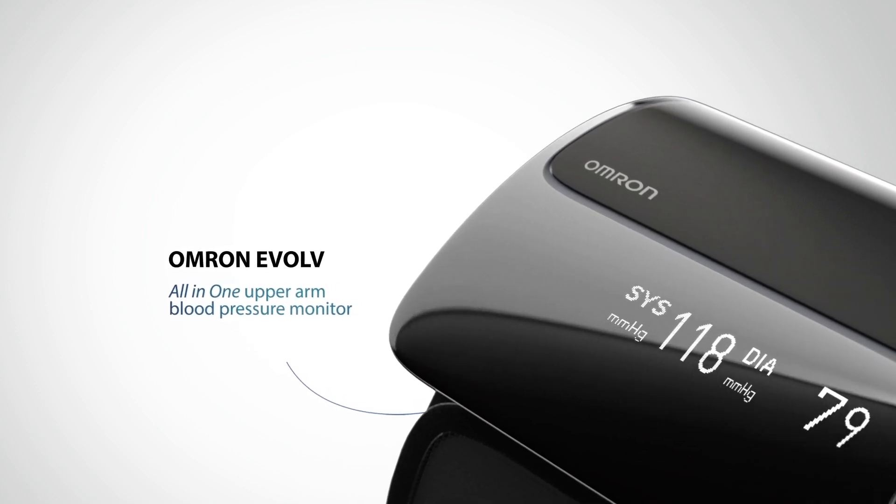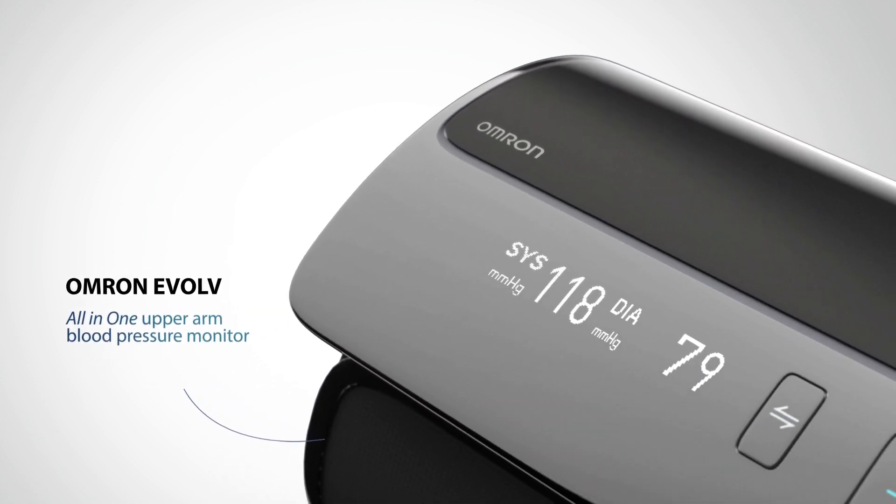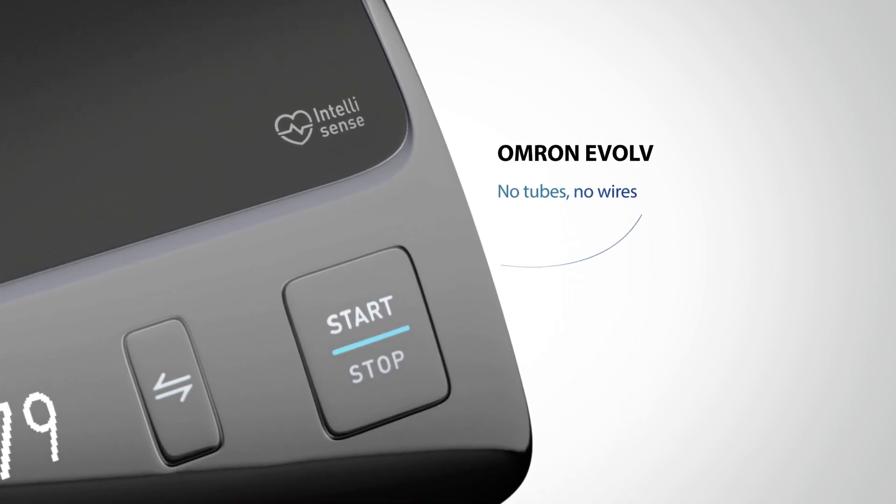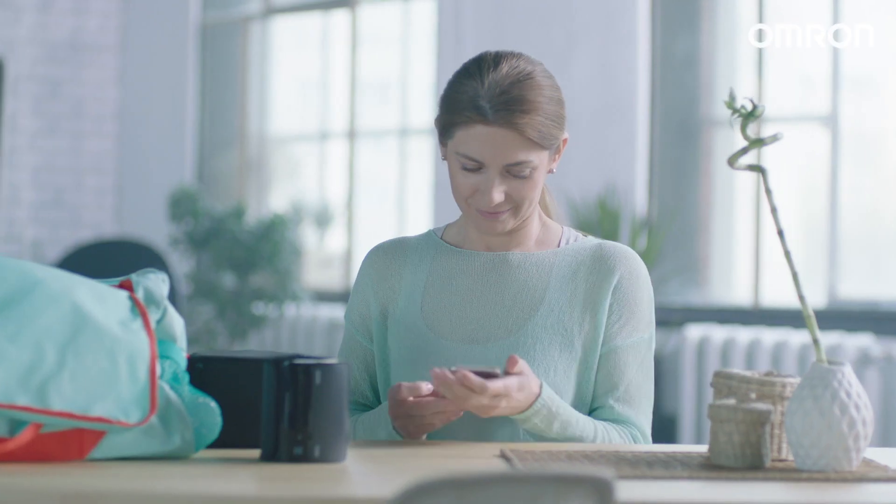This all-in-one upper arm blood pressure monitor is portable, has no tubes, and it ensures 360-degree accuracy in any position around the upper arm.